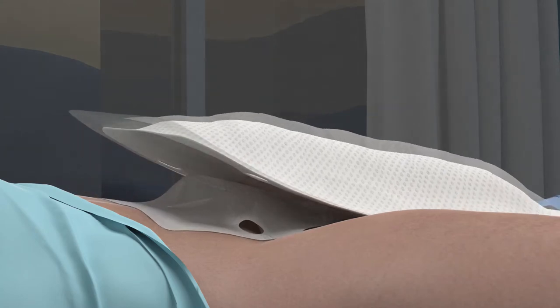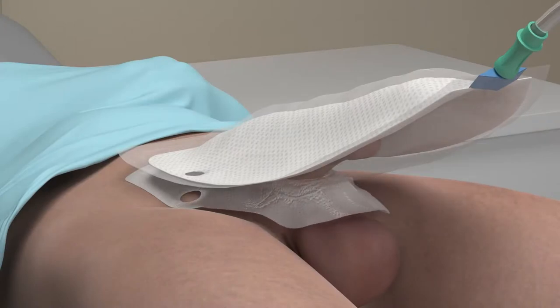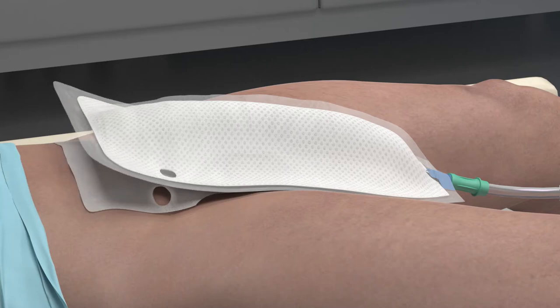Ensure the adhesive base has fully adhered around the base of the penis. Please note that the scrotum should not be placed inside the device. To remove the device, gently lift the top edge of the device off the skin in a slow downward peeling motion.